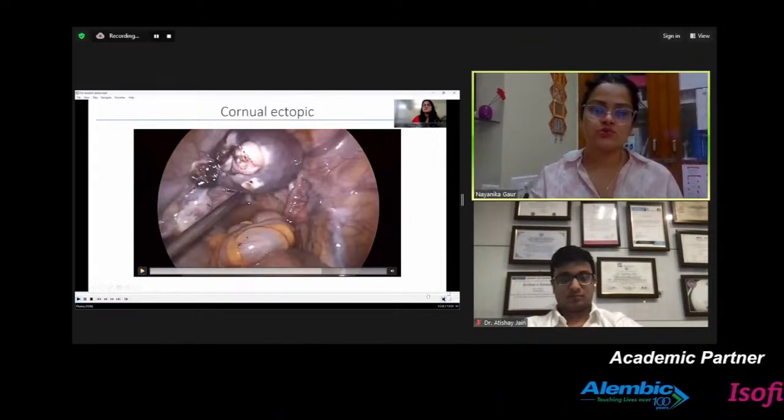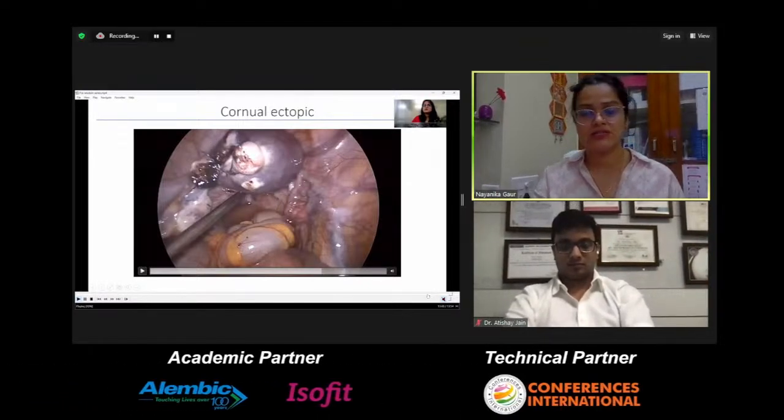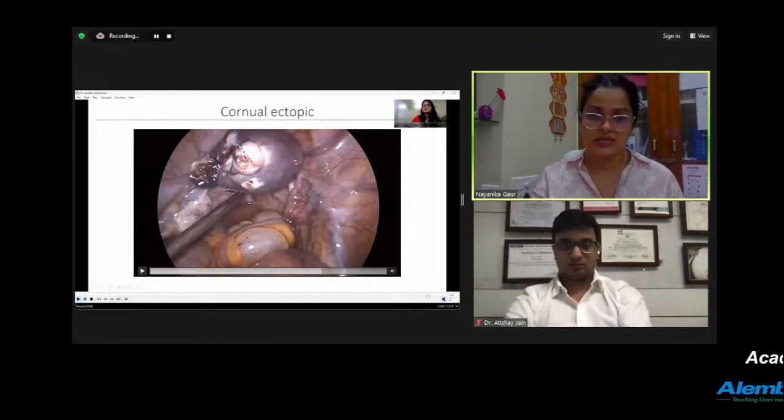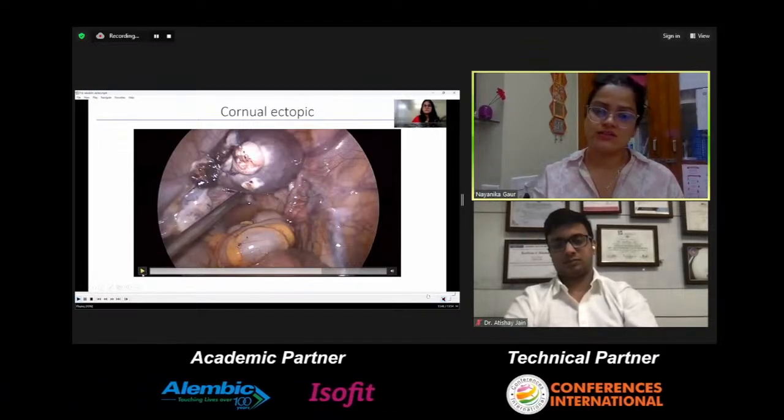And this is how it was sutured. Resection was done. This is a wedge resection done for this cornual ectopic pregnancy, and suturing was needed because, yes, a part of the myometrium is also removed while removing this ectopic tissue.